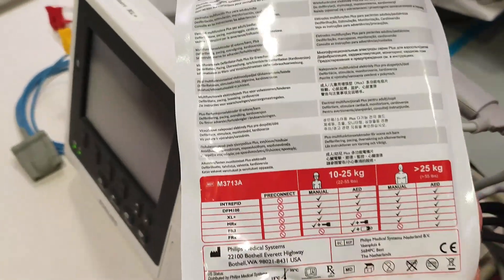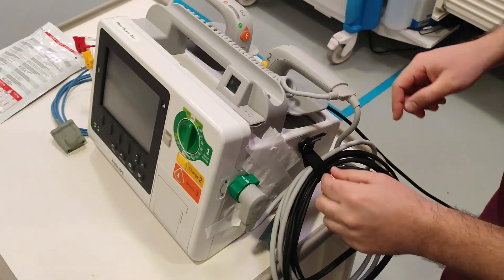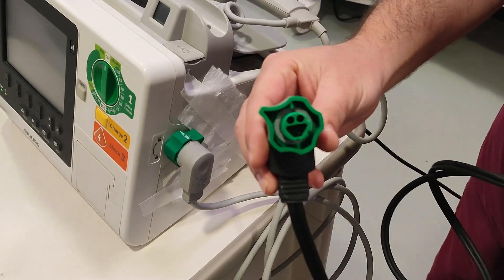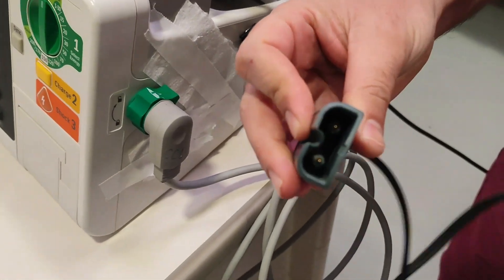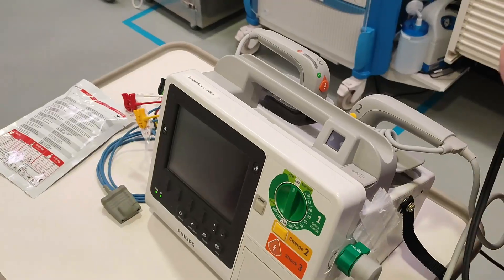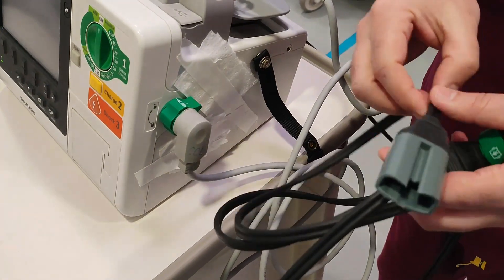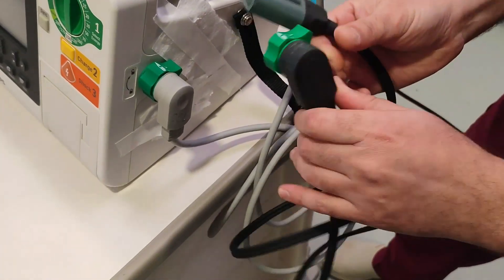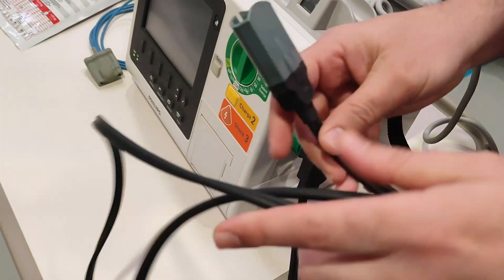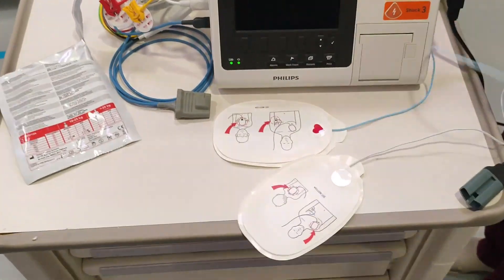If you are using this defibrillator with the paddles, connect this side. If you want to use disposable pads, there are disposable pads — I will show you how to apply them on the patient's chest. For disposable pads you need to switch this cable from the paddle cable to the disposable pad cable. As you can see, it looks the same but the port is different. Once switched, there is a click sound again confirming it's properly adjusted and not loose.